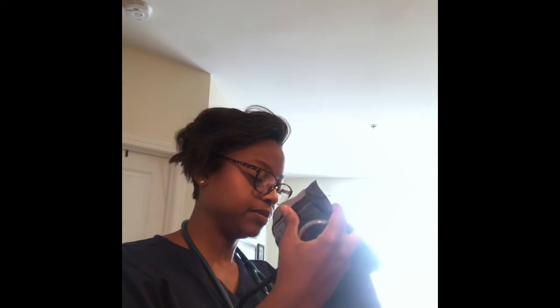So first off, I would take my blood pressure cuff and I would measure to make sure that it fit the patient's arm, making sure that it was half the diameter of their bicep. And then I would put it on comfortably, making sure that I line up the arrow with their left arm, their left brachial artery.